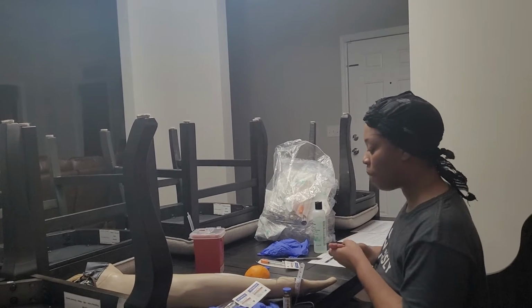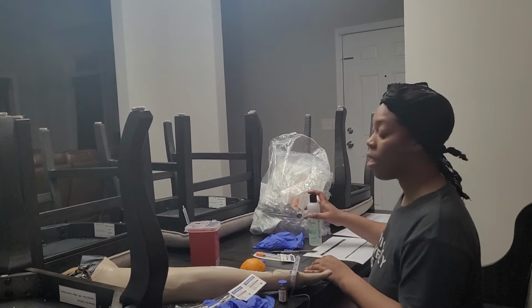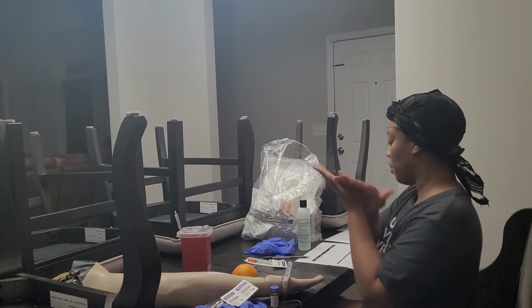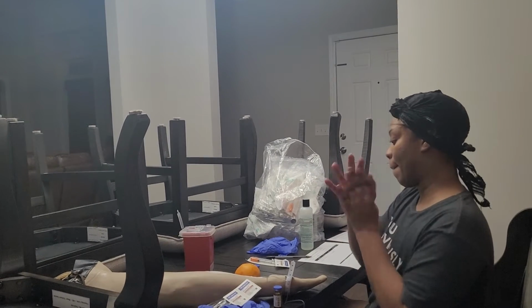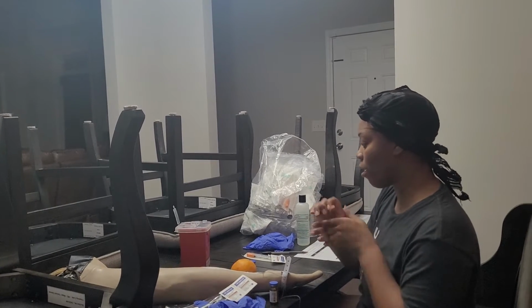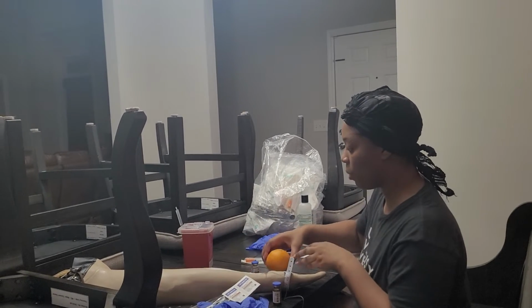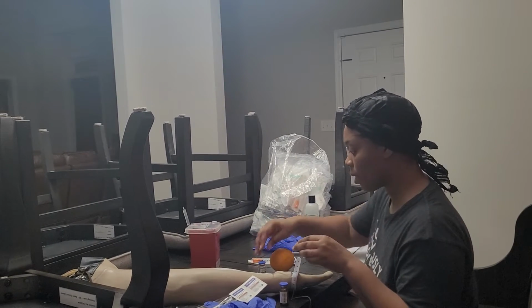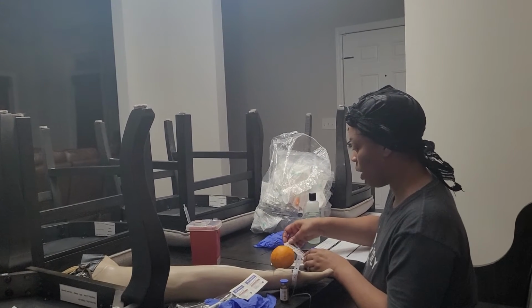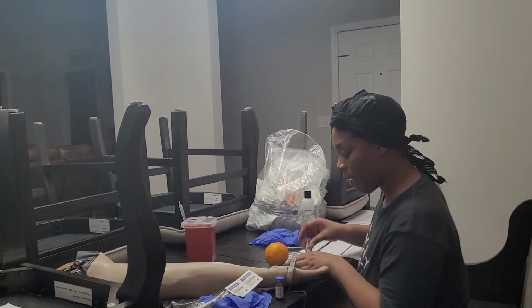Hi, Miss Larson. I'm Leah, the nurse, and I am here to administer your medications that are due now. First thing I'm going to do is my hand hygiene. I'm going to gather all of my materials here for my sub-Q. Have my medication, have my sub-Q needle, it's an insulin needle, and my alcohol prep pads.